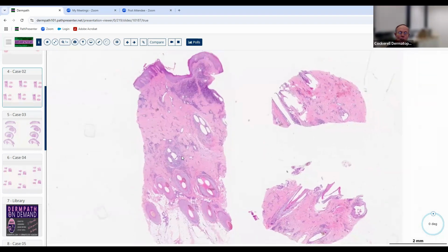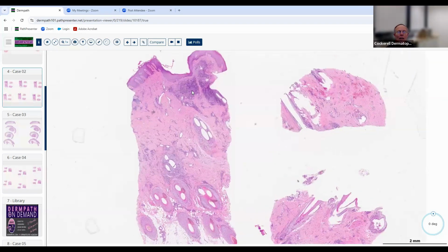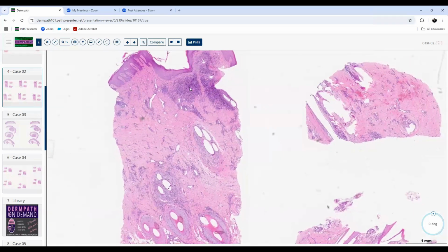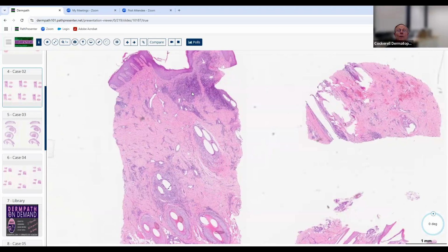Okay. And what kind of cells are we looking at? What kind of inflammatory cells do you think we're seeing here? So when I was looking, I see a lot of neutrophils and then also some lymphocytes and a few EOs. Yeah, at this power, the cells look pretty dark. Probably betting on lymphocytes as the predominant cell. Most likely lymphocytes. There are probably going to be some other cells too, like you said, and you've probably already seen this at high magnification, so you found those other cells there, but mostly lymphocytes.